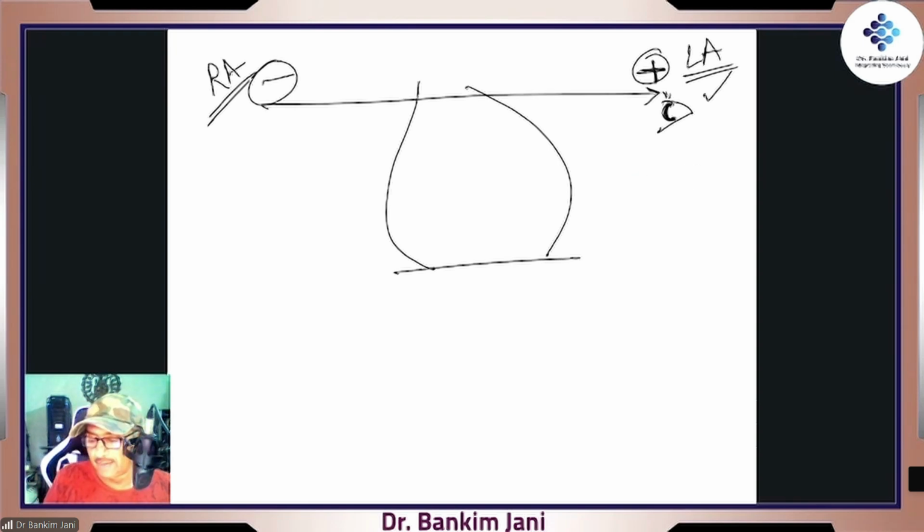So the point is, you are watching the heart in lead 1 from the left side. Is this part clear? Yes, no. Yes. Okay.